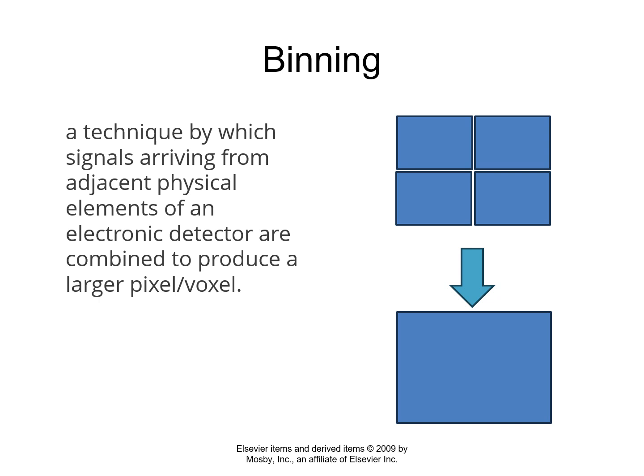Okay, binning. So binning is something that happens with fluoroscopic images and those rapid frames. One of the ways they shortcut building an image is you might have like a 1024 by 1024, but again, capitalizing on the way human vision works, you're not going to see the details.